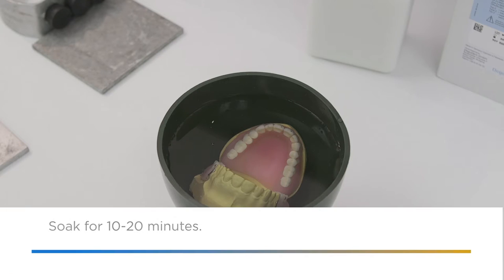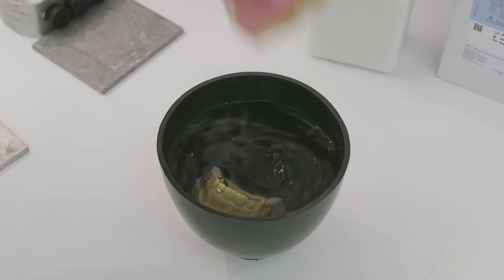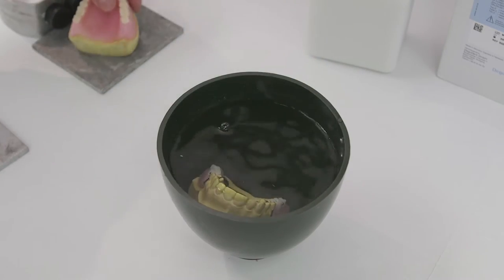Next, soak the denture wax up on the stone cast to hydrate the model to prevent porosity. Soak for 10 to 20 minutes prior to pouring the mold material.